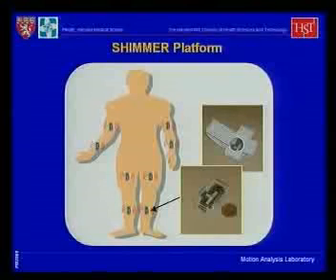They run at this point in time without duty cycling on the radio. They run on a 250 milliampere hour battery for about 12 hours.